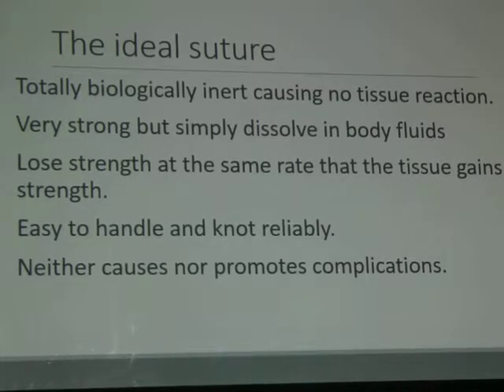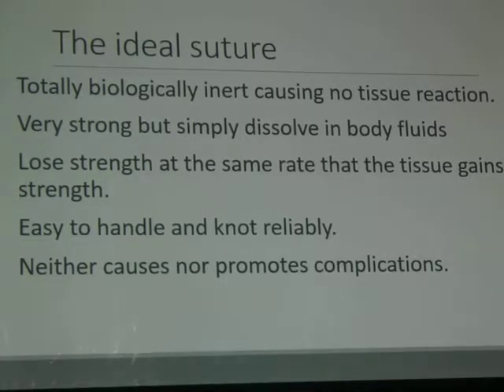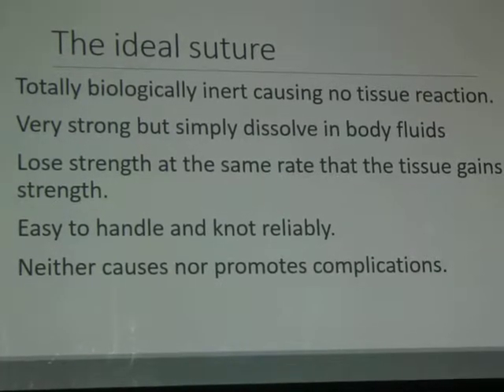او واير. It's very difficult to handle. هو very strong, it will maintain tissue in place but it is very difficult to handle.